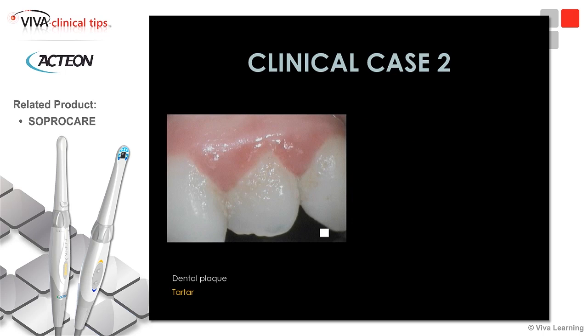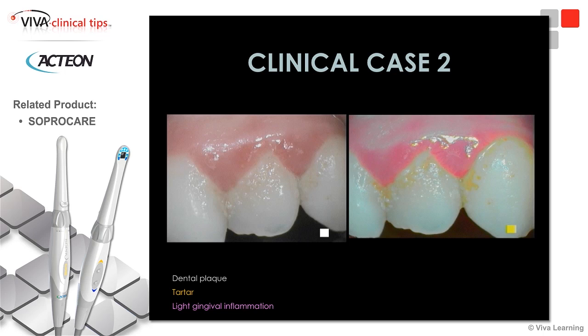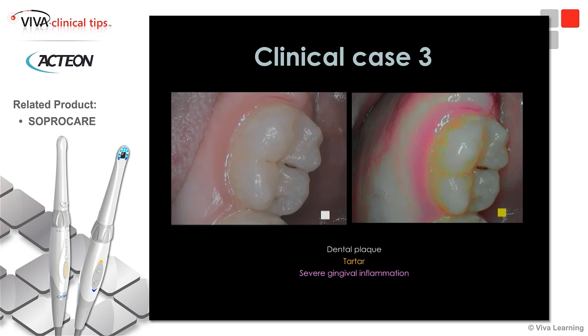Hygienists and dentists on the webinar tonight, you can see the plaque there. You can probably see the tartar. You can see the inflammation in this picture. But the patient may not be able to see it at the same level until you flip on Perio mode, and now they can see it. So it's an incredible tool that helps us better discuss with our patients what we see. They can finally see what we see.